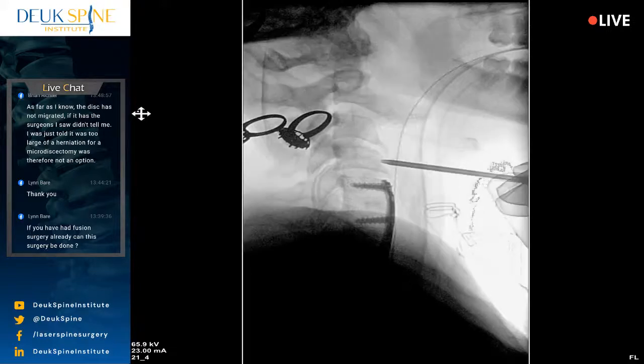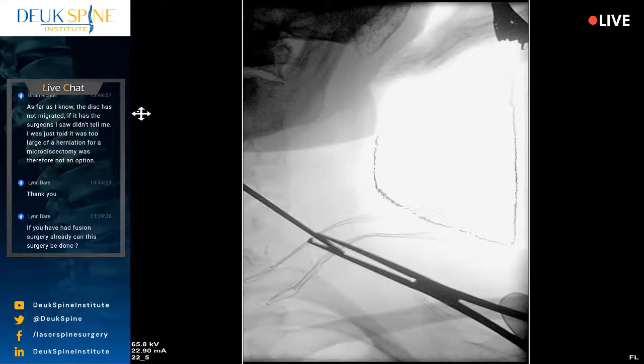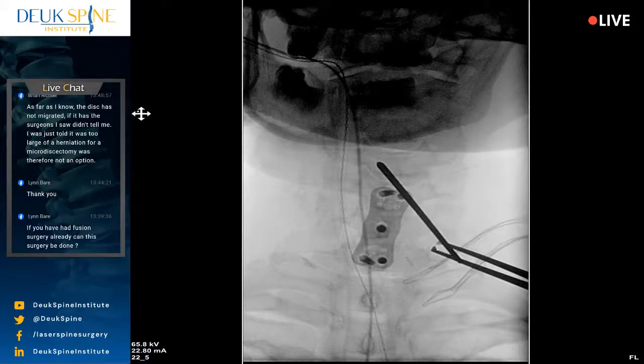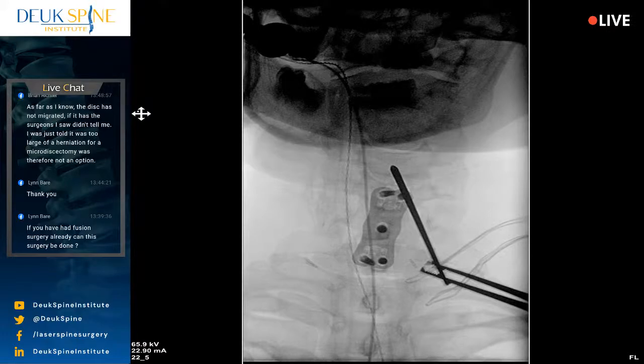Shot. Shot. Everyone stay where you are. Let's see where I am. AP, Coker. Watch your hand. He's going to bring that up. He doesn't want to hit your hand. Lower your hand a little bit. Feel like I'm off to the side. Let's see. I think I'm on your side. Shot. Just a quick AP, buddy. This is not a Mona Lisa. Come on. Get that right. Yeah, I'm a little bit off to your side. I'm going to come back to my side. Shot. That's good. Shot. Lateral. Don't move.